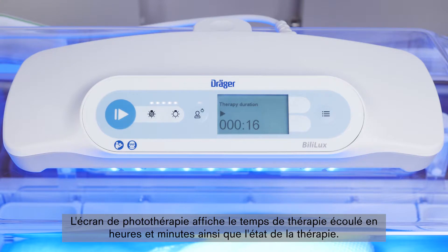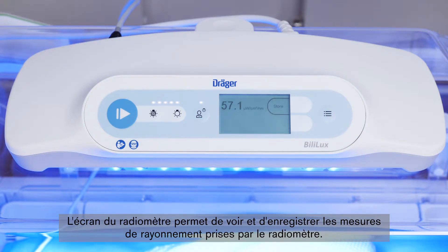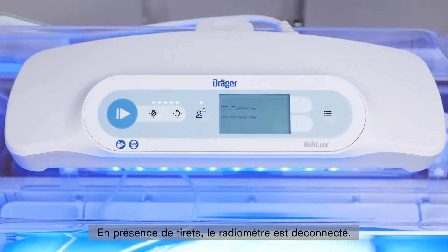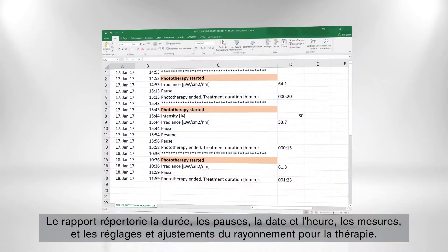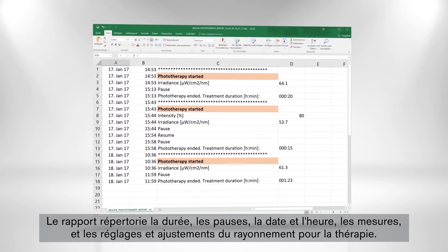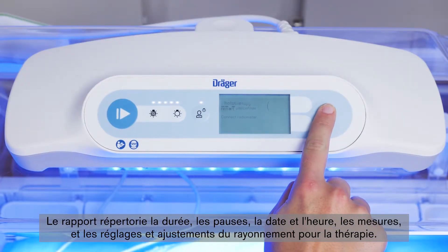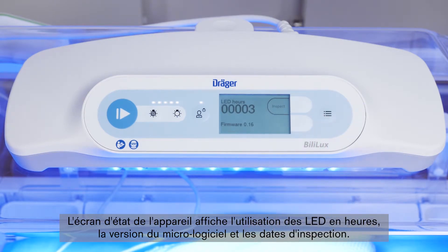The following screens can be displayed. The phototherapy screen shows the elapsed duration of therapy in hours and minutes, as well as therapy status — the double dot blinks when the phototherapy light is running. The radiometer screen allows the user to view and store irradiance readings; if dashes are shown, the radiometer is not connected. On the phototherapy report screen, you can export the phototherapy report to a USB flash drive, containing a log file of therapy duration, pauses, date and time, irradiance measurements, and irradiance setting and adjustments. The configuration screen allows you to adjust date, time, and language. The device status screen displays LED usage in hours, firmware version, and inspection dates.